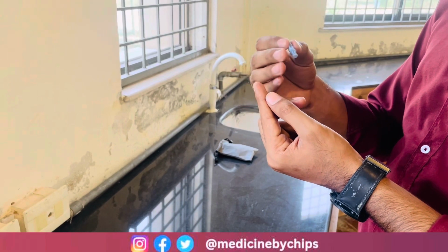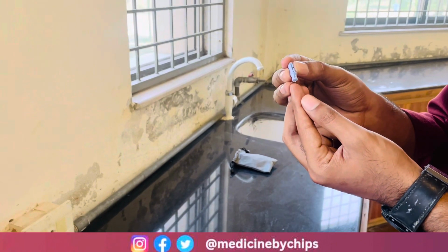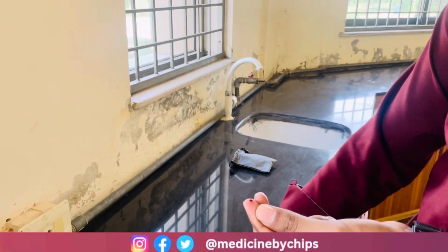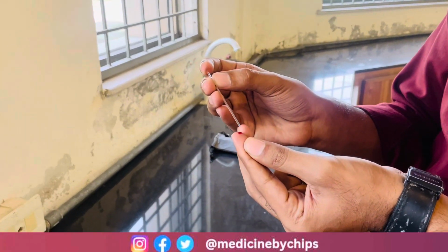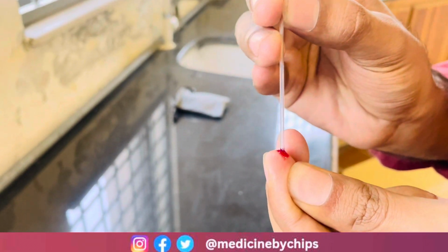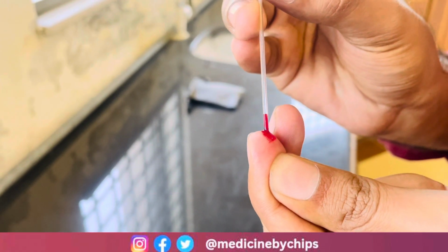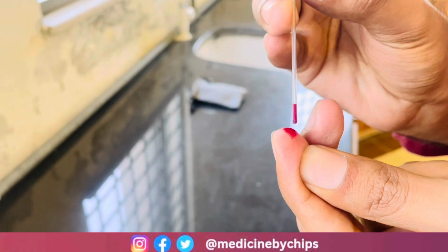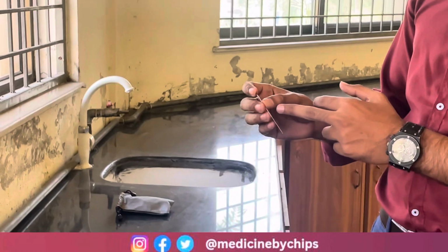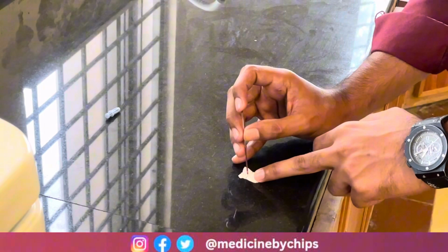We will use a swab so that there is no infection or any other risk. Then we will prick the finger just like this. The blood will come out. Then we put the capillary tube on this, and the blood will automatically move into the capillary tube, just like this. Now you can see that the blood has risen up to half of the capillary tube. Now we will seal it with the help of clay, like this.